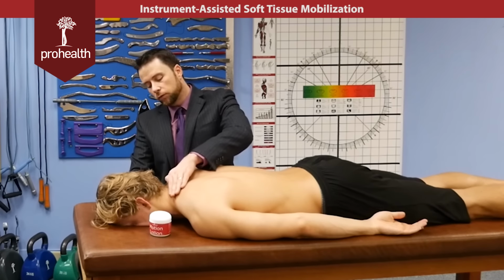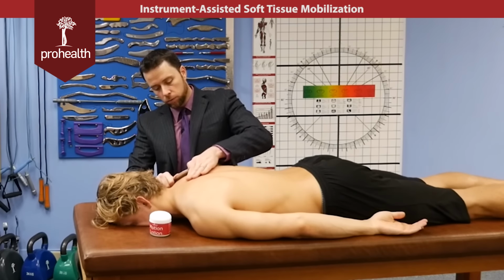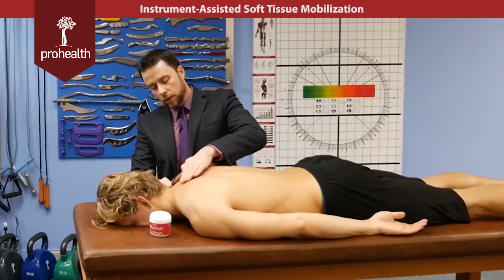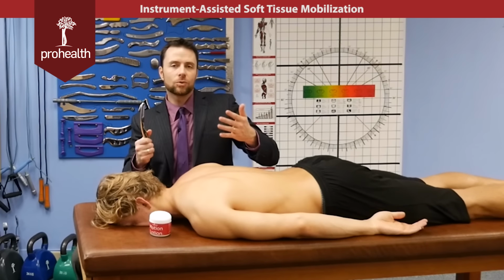Okay? There are different protocols that we can use that involve active range of motion, passive range of motion, and stretching, but just to see a basic fiber pull through right here. You can imagine, now this guy's about 200 pounds that we're working through right here. This requires a fair bit of force to work on somebody this size. How much this would actually save your hands.